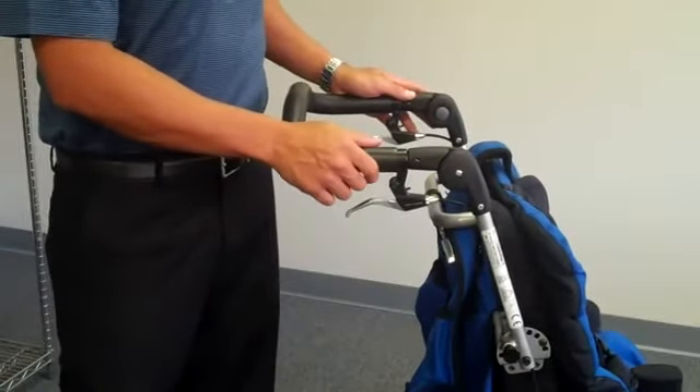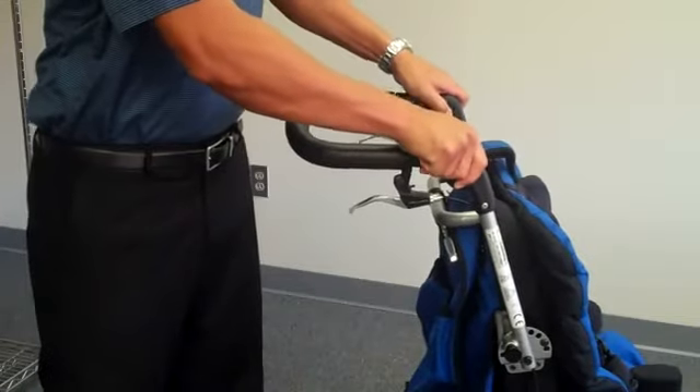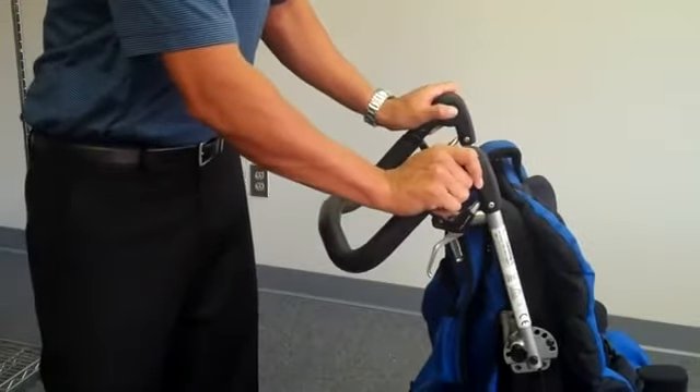To raise and lower your push handle, simply push on your gray push buttons to lower, and to raise.